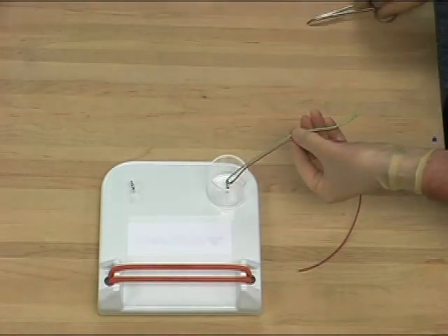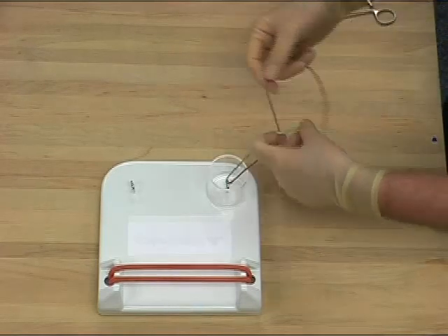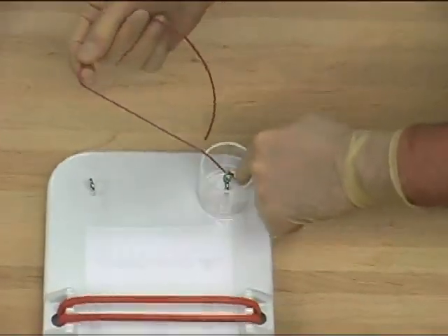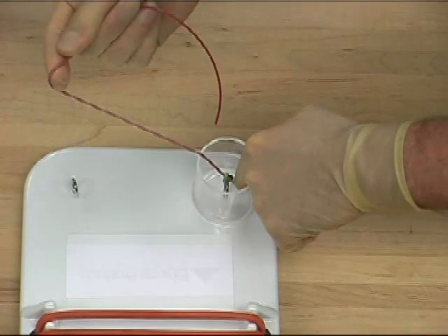A forehand throw, as in the first knot, is created. On this occasion, the knot is carefully placed using the index finger of the tying hand, and the knot tightened down by a balanced pull of the two limbs of the suture, so as to create no traction on the structure being tied.